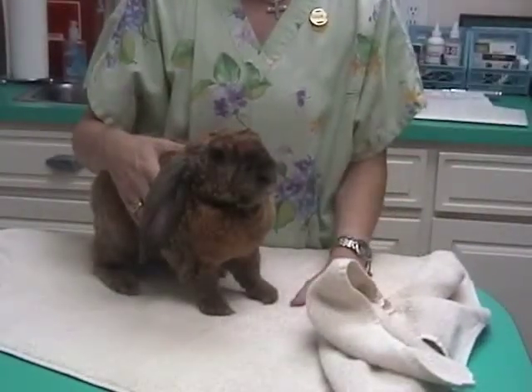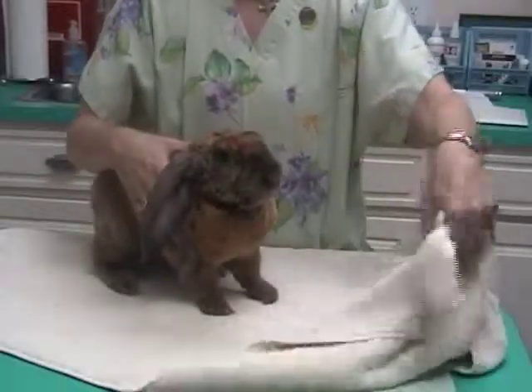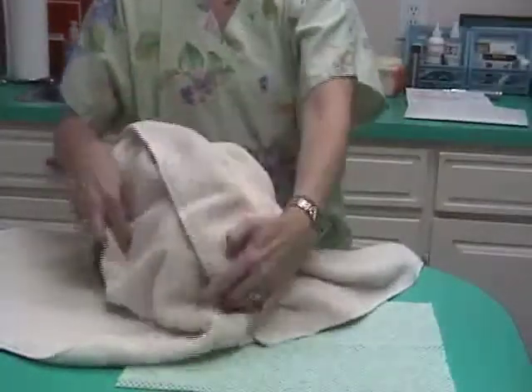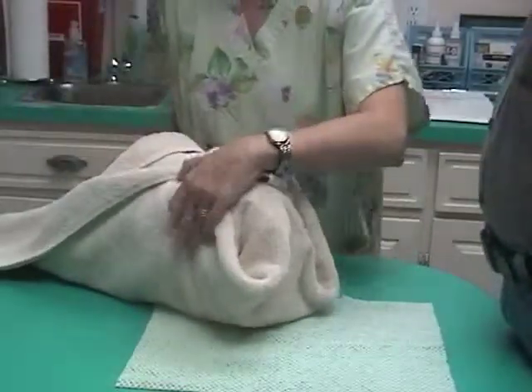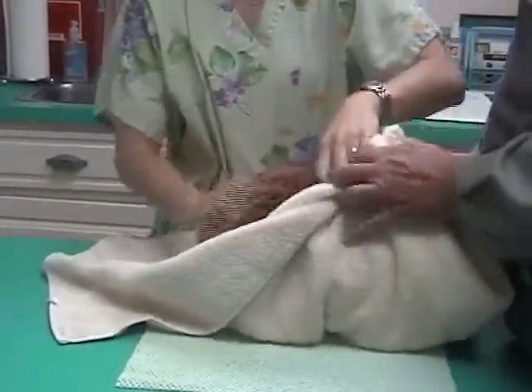Going to give Pixel some subcutaneous fluids. First, I'm going to wrap her up in a burrito. So you take a towel diagonally placed and stand her kind of diagonally. Pass one corner over the nose and pick up the two sides. And you have your helper kind of maintain the front.